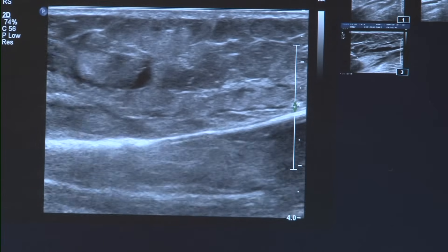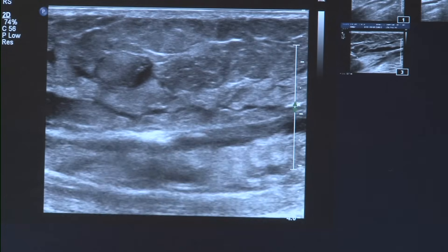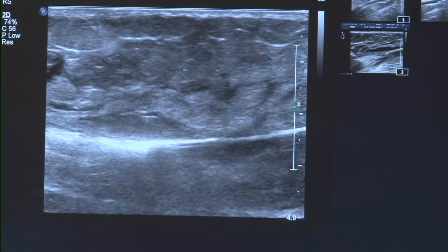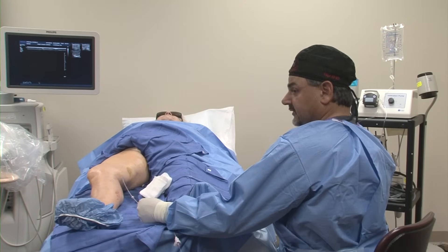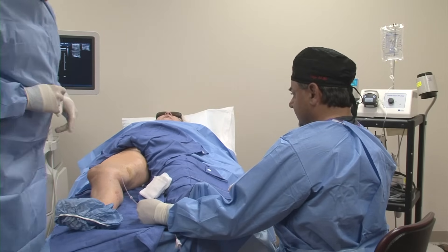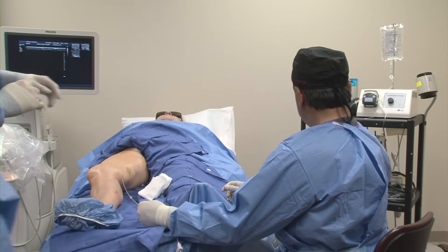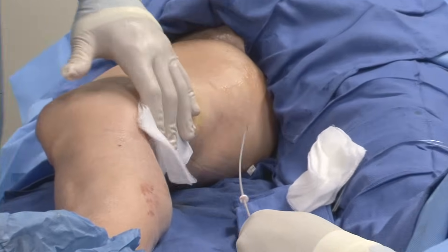Now we just sit back and do a nice slow pullback. There are some automated pullback catheters available on a rail, but we tend to use the manual pullback which has worked very nicely for us. We're getting very close to our exit point. Once you're at these little tiny markers, that tells you that you're at the end of the catheter, and I am pretty much out. I'll stop right here and Jason holds manual pressure.